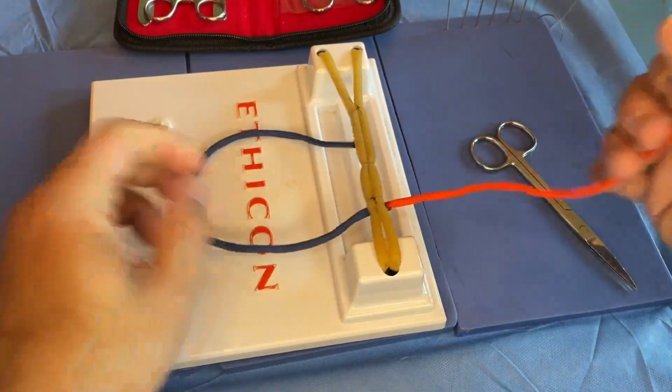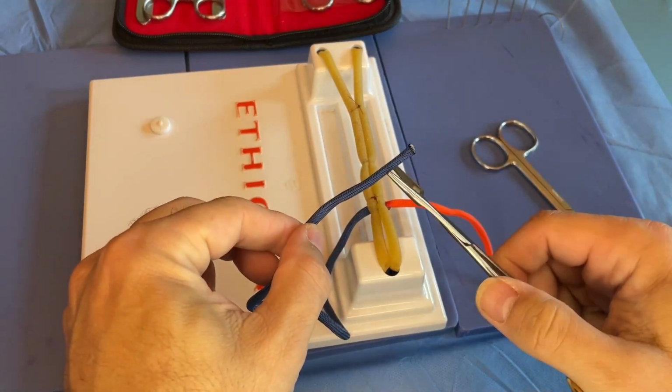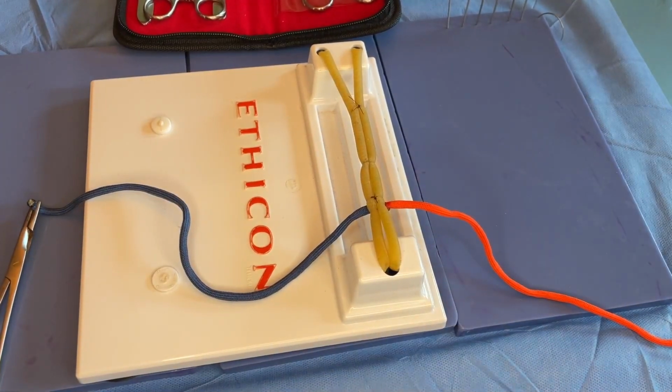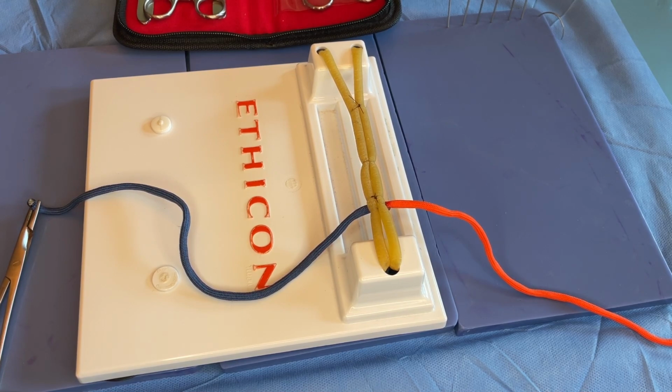Let's talk about a 1-handed knot. Technically speaking, as long as you're throwing nice, consistent square knots, 1-handed or 2-handed knots should be equally secure. I do think there's a bit of a stereotype, and I must admit that I have this preconceived notion a bit myself, that 2-handed knots are a bit more secure. So I typically do 2-handed knots whenever possible, especially for vascular pedicles where I'm really counting on a good tight ligature around it. But 1-handed knots sometimes just for access. If you're tying, say, during a TAH down around the uterine artery, I do 2-handed, but when I get to the vaginal cuff, or if you're really deep, sometimes 1-handed is what you need to do.